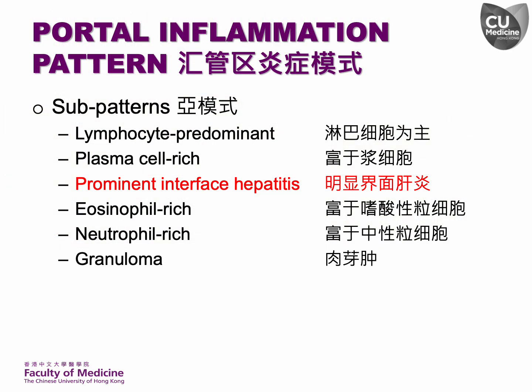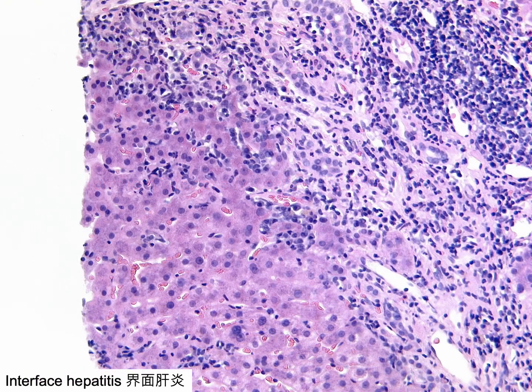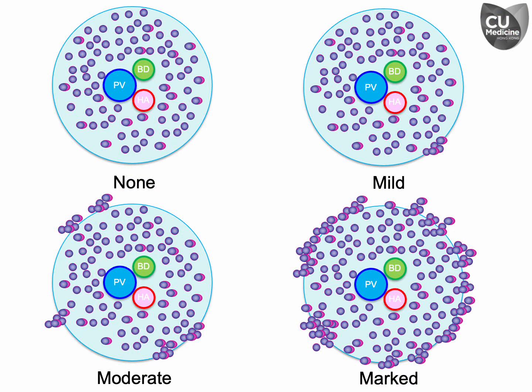Prominent interface hepatitis is another sub-pattern of portal inflammation, demonstrated here by multifocal interface hepatitis breaching the parenchymal-mesenchymal interface. How do we define prominent interface hepatitis? Let's see how we assess the severity of interface hepatitis, i.e., grade the interface hepatitis.